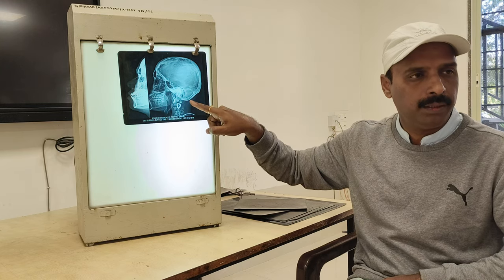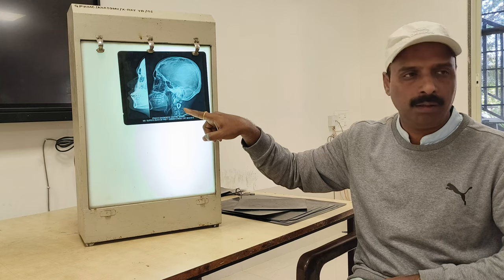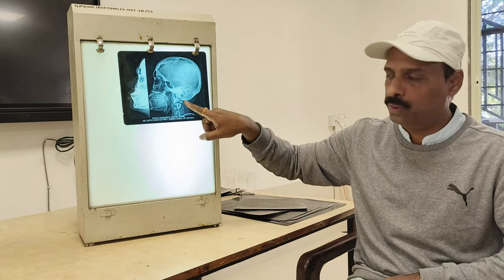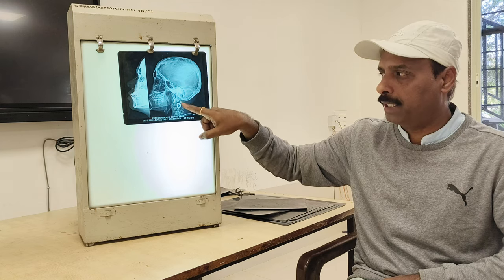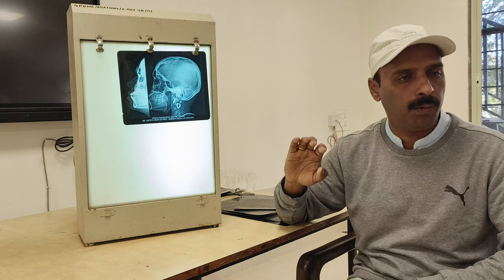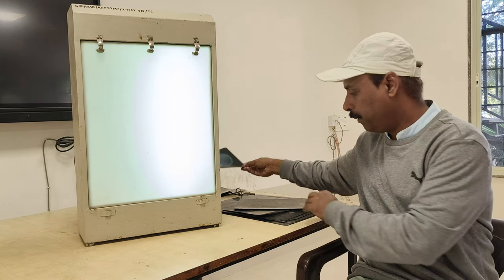Here we have to remember the cervical spine. We get all the upper seven cervical bones, in which we are going to see the atlas and axis, and the third and fourth cervical vertebrae. So this is what you can remember about the lateral view of the skull, and this is a plain type of x-ray.